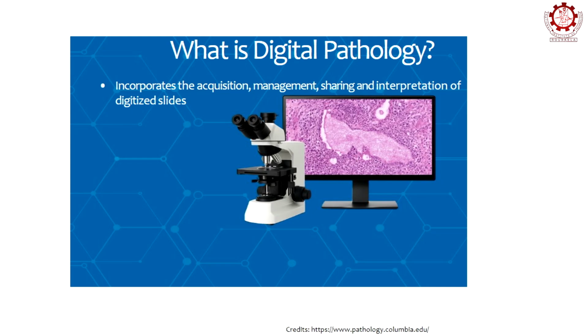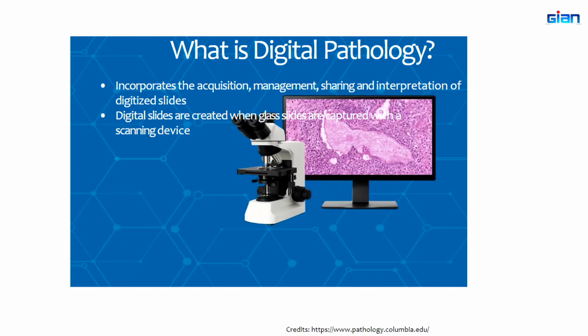And then interpretation. Multiple pathologists can sit at the same time and interpret the same image at different locations. So digital slides are created when glass slides are captured with a scanning device, and we'll see what the scanning device looks like.